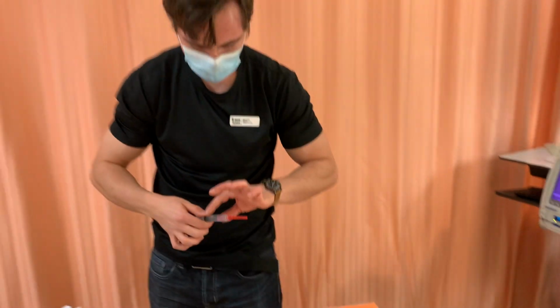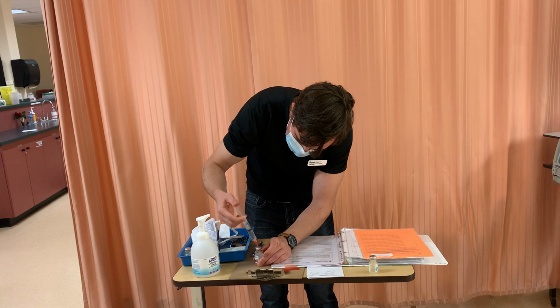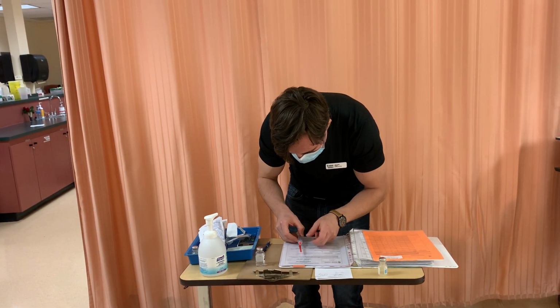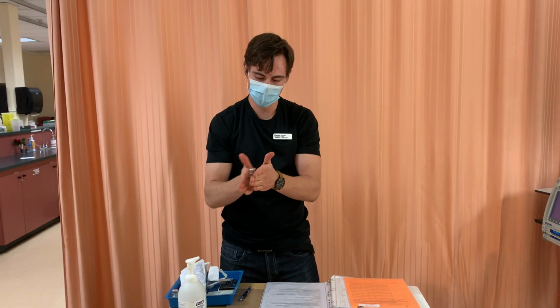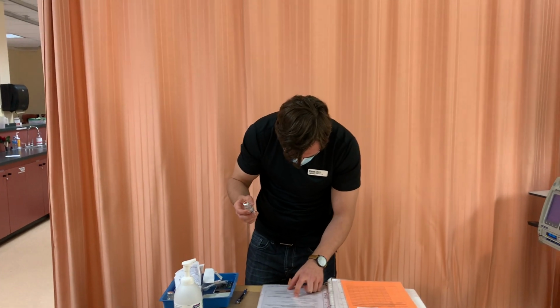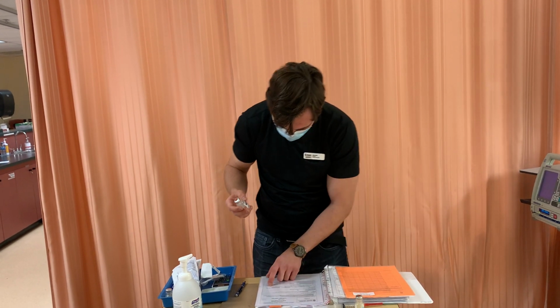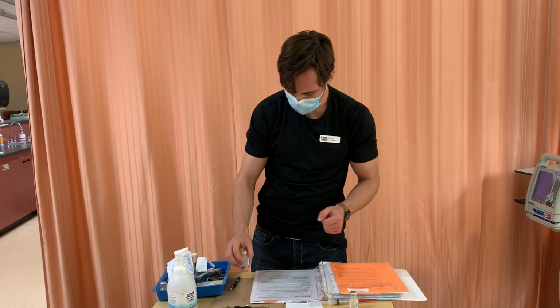Here you go. I'm going to put that into my vial. I'm going to roll it. Now I let the air out. I have a total of 20 ml in here. Do the scoop method. So now I'm going to gently rotate this in my palms, making sure that it is fully reconstituted. So I have the full 20 ml of sterile water in here, final volume of 20 ml. That means I have a concentration of 50 milligrams per ml. So for our dose of 500 milligrams, I did my math here, and I need 10 ml, so I can do that.